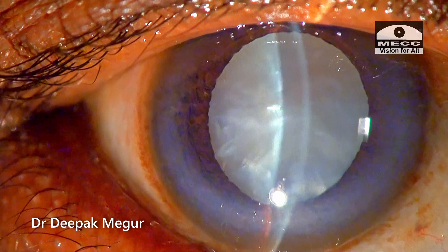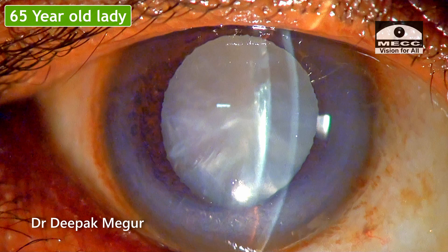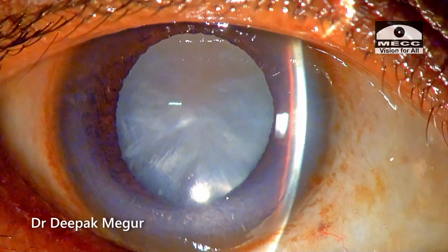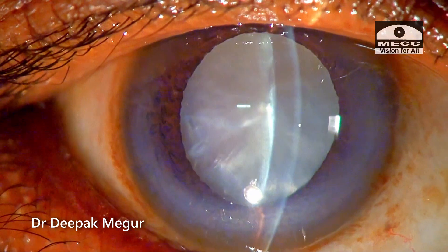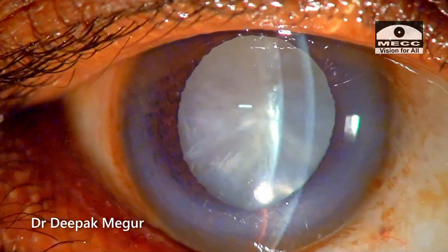I'm here with yet another case of an intumescent cataract in a 65-year-old lady. The central anterior chamber depth is just 2.14 millimeters, the capsule is extremely tense, and we can see there's an iridocorneal contact in the peripheral part of the anterior chamber. The challenge typically will be how do we do rhexis in such eyes.